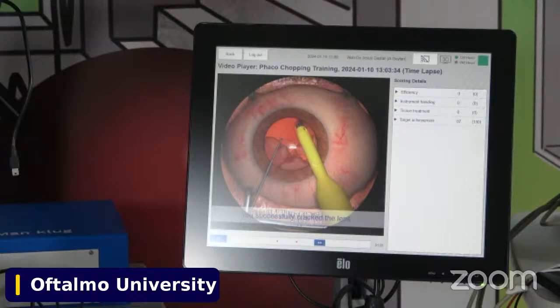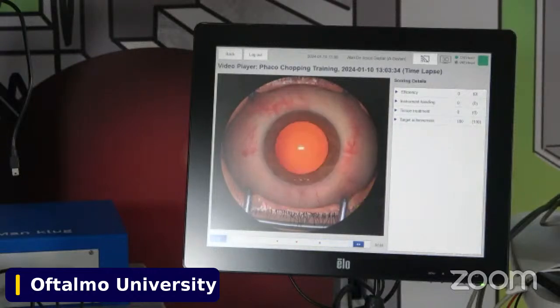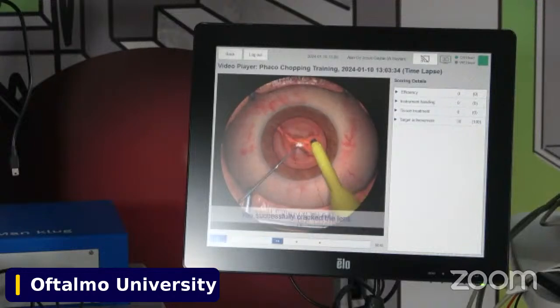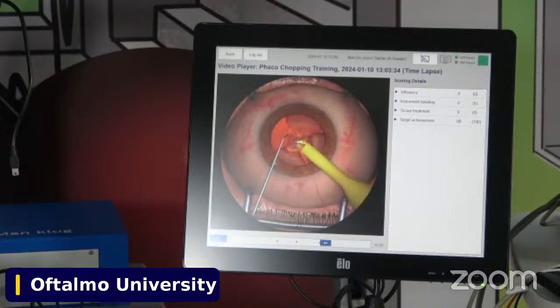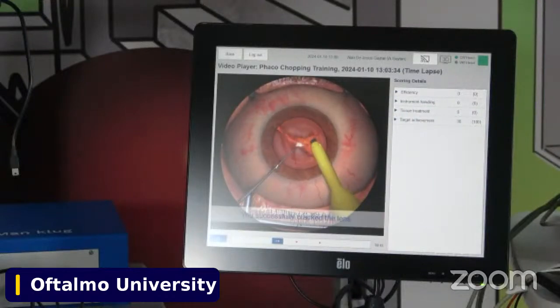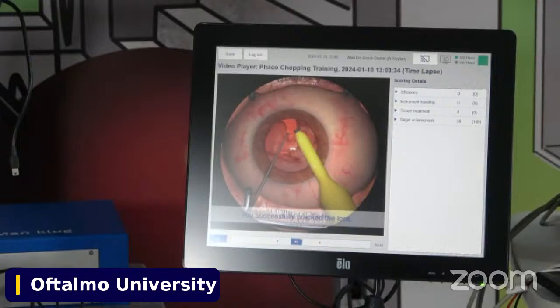And the machine is going to tell you exactly, objectively, what your score is, first thing. And second thing is if you made mistakes and which mistakes. So the next time you simulate, you can improve it. I would like also to ask first Atanas and then Florian to tell me how powerful it was in your training to have objective feedback when you were training. Atanas, what do you think?